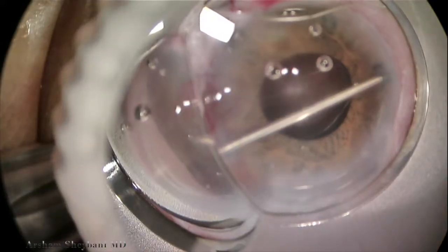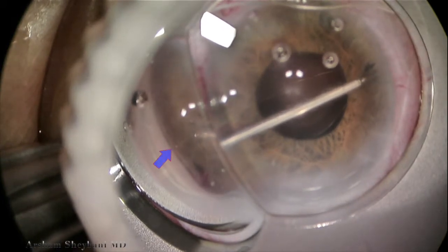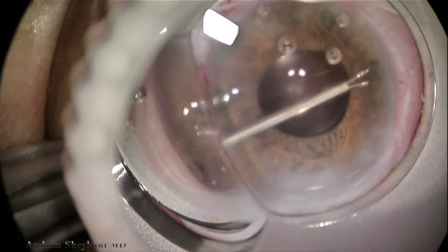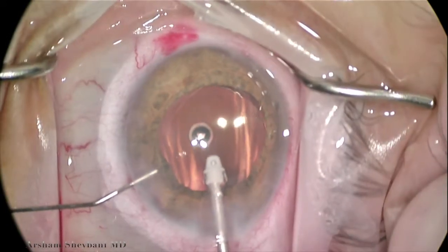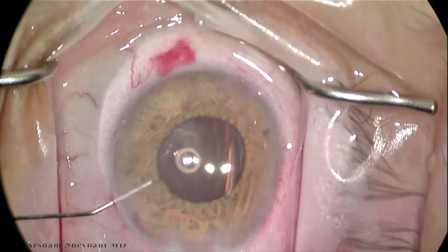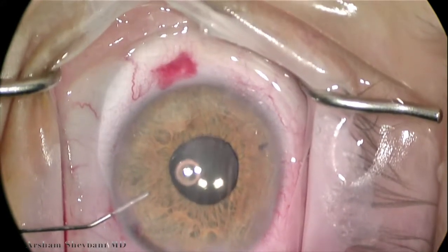We continue to do that for the majority of the case. It's a very tedious process — you need good optics, and the single mirror has a nice recessed portion through which you can work. Here we're showing the areas that are open after the synechialysis. We inject miochol back into the anterior chamber at the conclusion of the case to constrict the pupil.